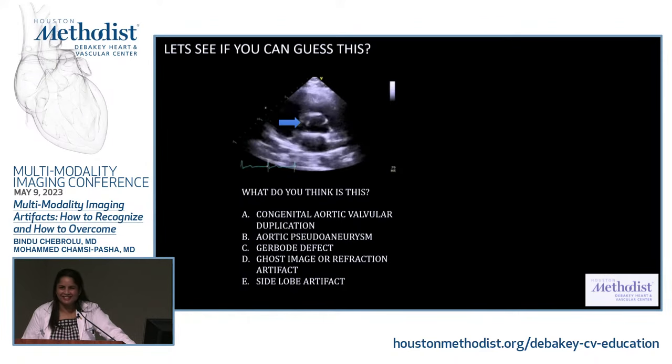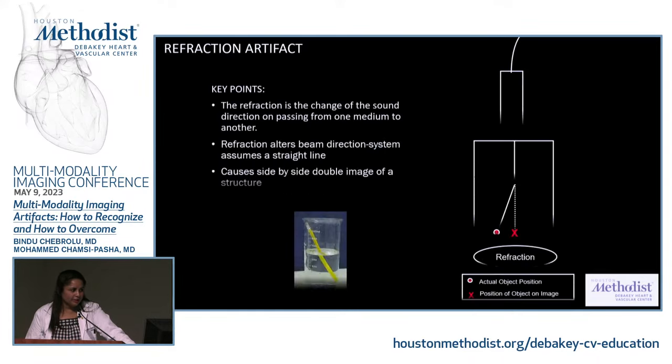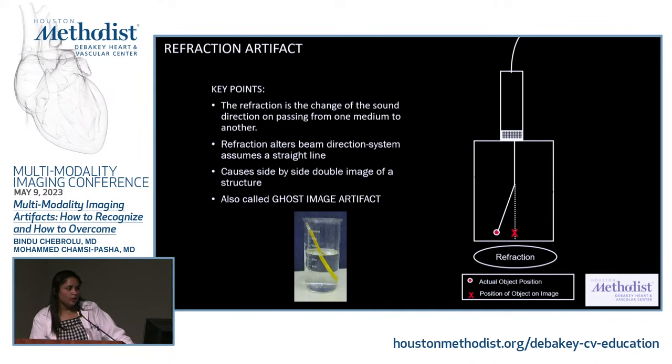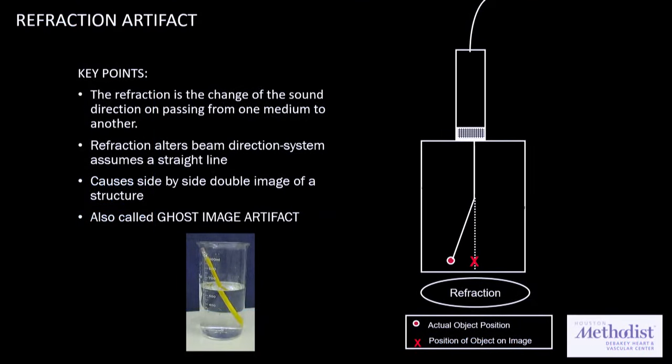Well, you guessed it, that it's an artifact, right? So it's actually a refraction artifact. I think somebody already said that. So what's different in this? Basically, it's the change of direction, right? The reflection of the sound in a different direction is basically refraction.